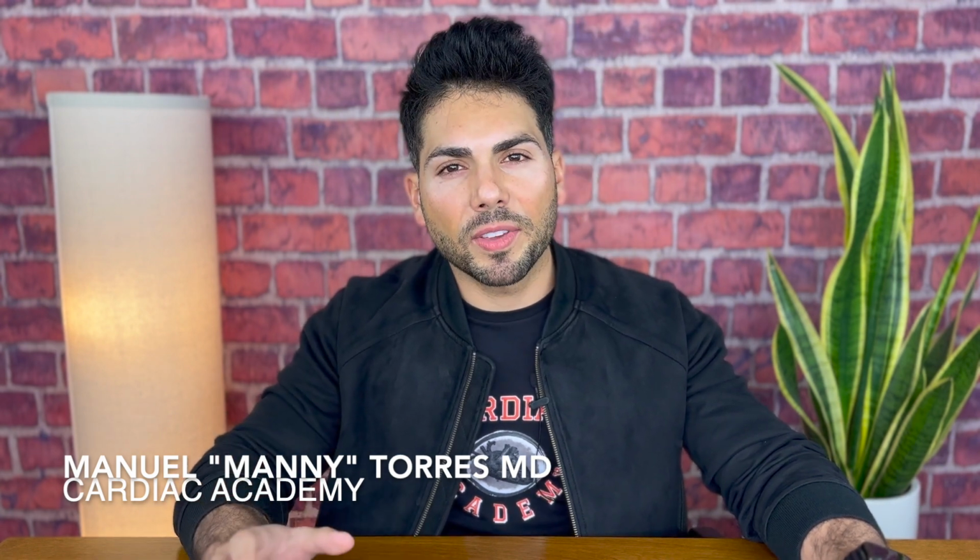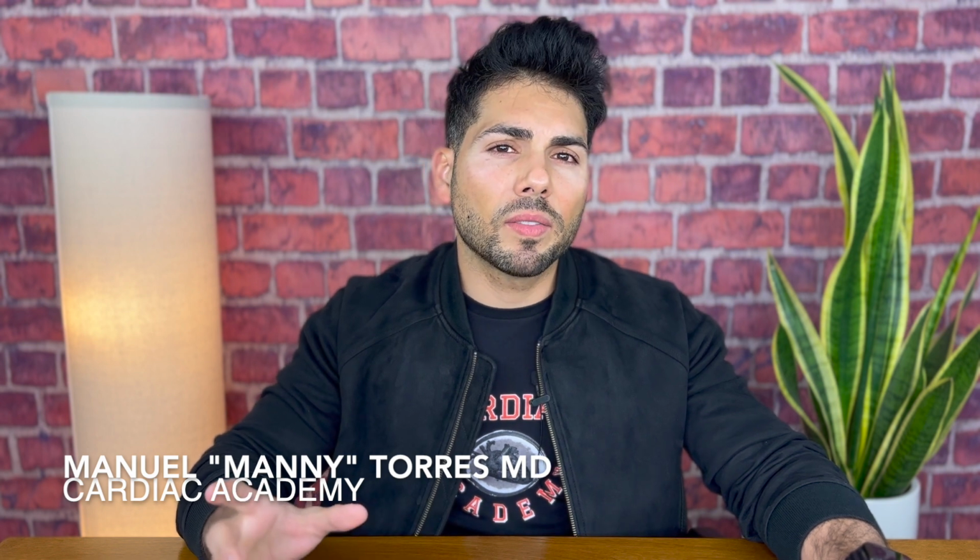Today we continue our video series on point of care echocardiography. In our first video we talked about the parasternal long axis view, so today it's all about the subxiphoid view and the IVC. This is an important view, so let's get started.